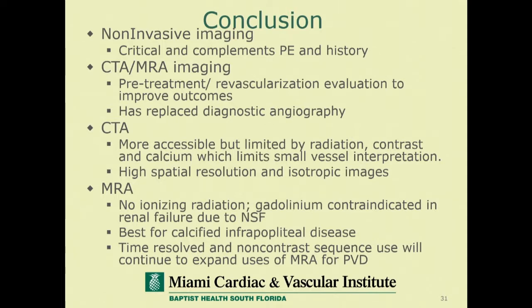Again, non-invasive imaging is critical and complementary to our physical examination and history. CTA and MRA helps us get that map, and I prefer MRA in our CLI patients.